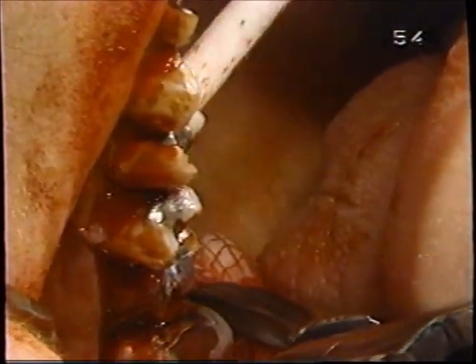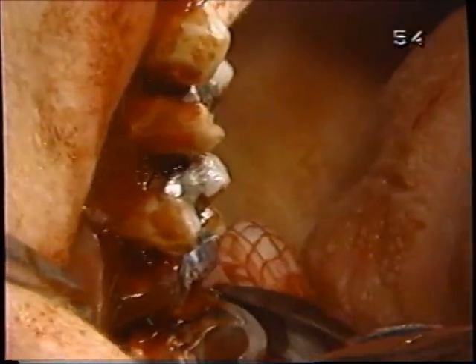Having luxated, we will now use the universal forceps in the long axis with buccal lingual motion, with heavier motion, heavier pressure towards the buccal, only because the bone is slightly thinner there. Now, in fact, the buccal motion here is the major one everywhere except the lower molars. On the lower molars, the bone is thinner on the lingual.